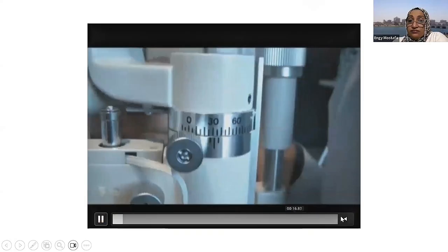So here is more magnification and more going forward towards the patient, okay? And using the same slit lamp. Here the patient has vitreous opacities. Let's see that again. Here are the vitreous opacities within it. That's with the same optical section, but moving the illumination and viewing system just a little bit forward. We are talking about millimeters forward, which allows us to see more.